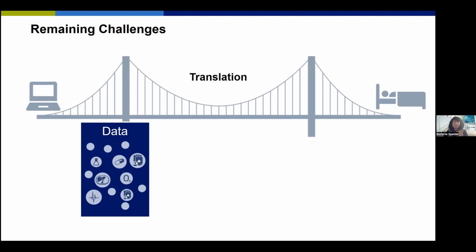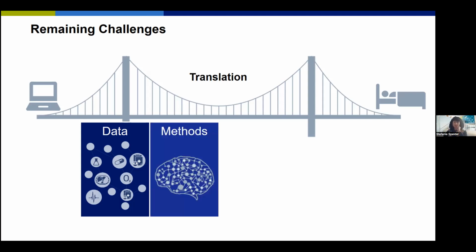So is the data available we want to visualize? And does it need to be pre-processed? Because a lot of times, as I have shown in the navigation system, the data needs to be pre-processed. So someone has to segment it and to reconstruct a 3D model out of it. And maybe that is not the only data we want to visualize, and so on. So there is a lot, and also regarding patient security and privacy. I mean, this is also a big topic. Then methods.